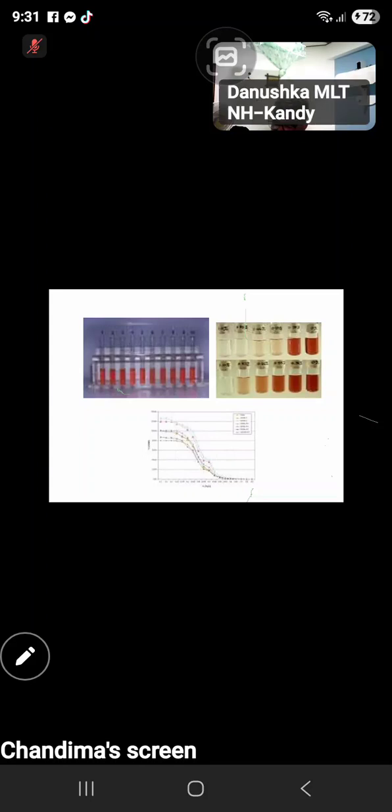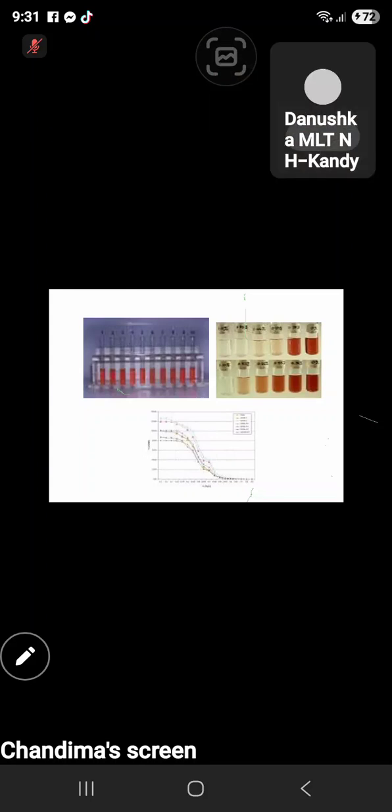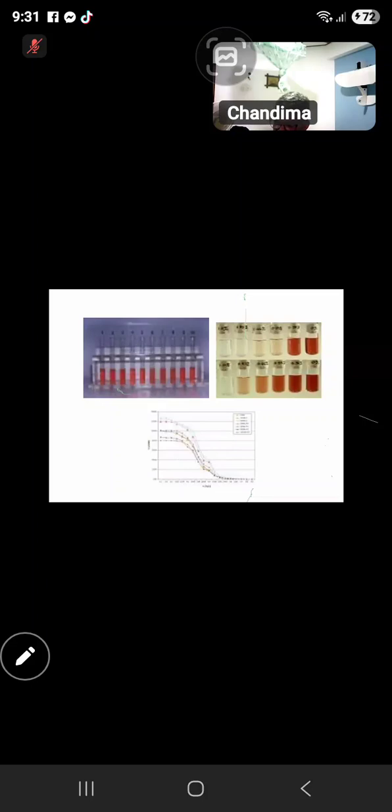So in case of specimen collection, what would be the ideal specimen? Normally we say the best one is non-anticoagulated fresh blood. You can ask the patient to come on the day that you are going to do the test, draw the blood sample at that point, and add it dropwise from the syringe or pipette without anticoagulant.